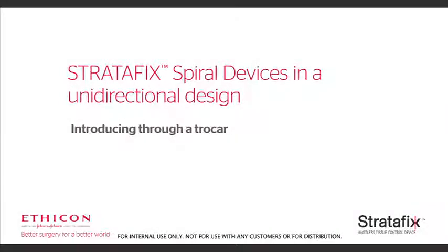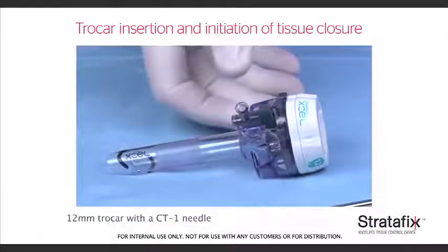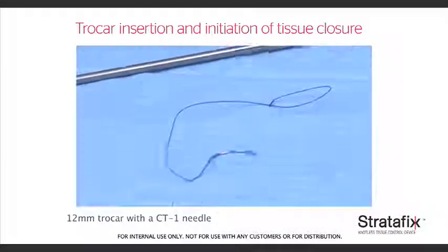In this video we will see the proper technique for introducing the unidirectional Stratafix spiral knotless tissue control device through a trocar, as well as how to initiate closure with the device. For this demonstration we used a 12 millimeter trocar with a CT1 needle.